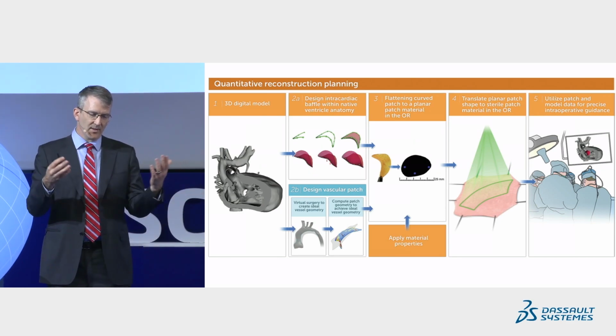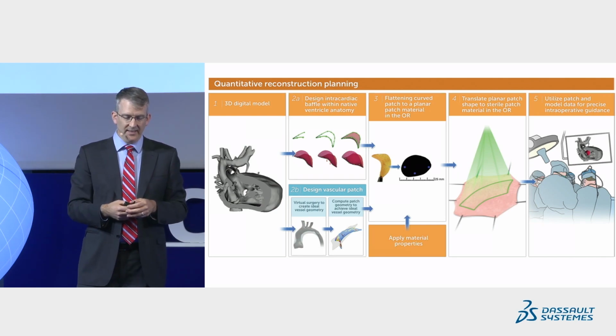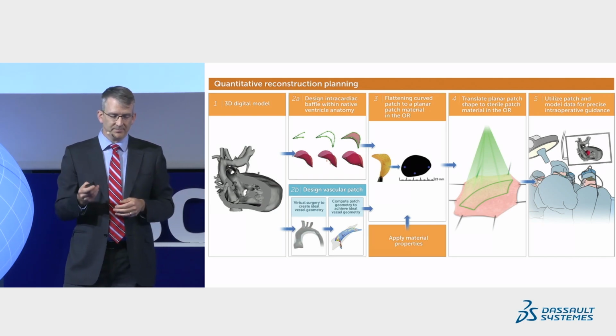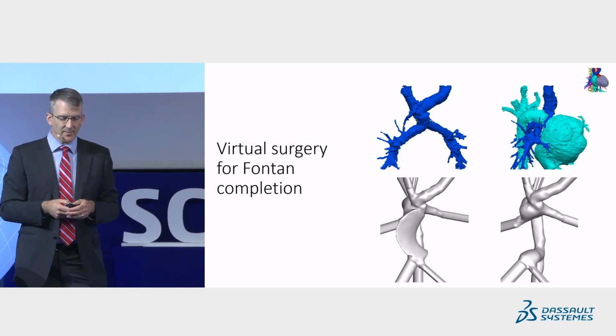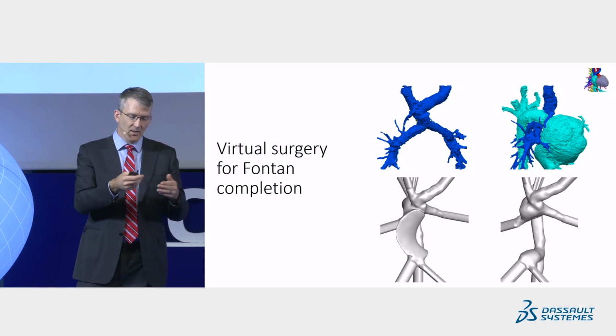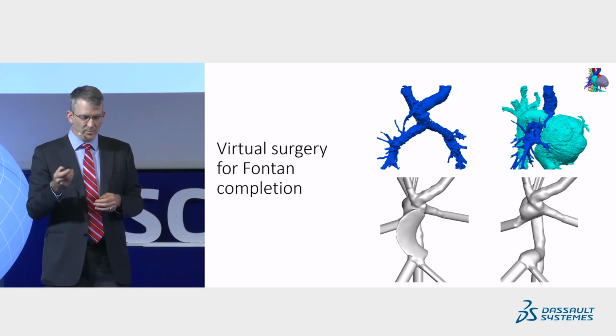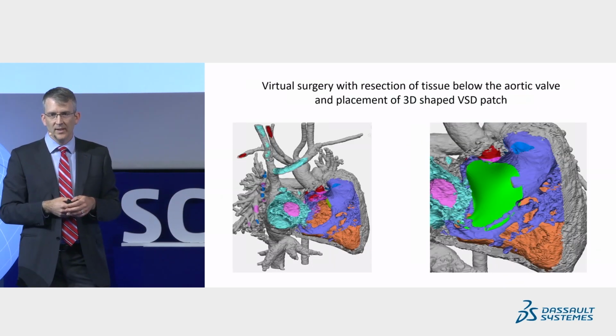And so what comes of this is a 3-dimensional shape. We're able to flatten that and then transfer that into the operating room. And so this is one example of virtual surgery. So this patient here we're considering for a Fontan, we can model the different Fontan options with a virtual surgery approach.